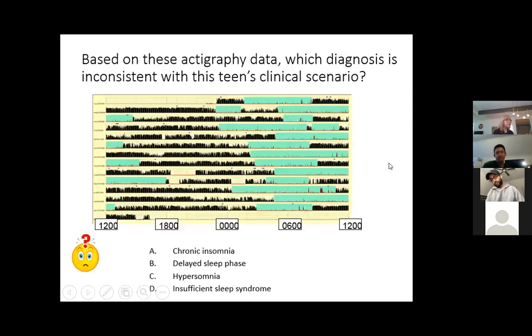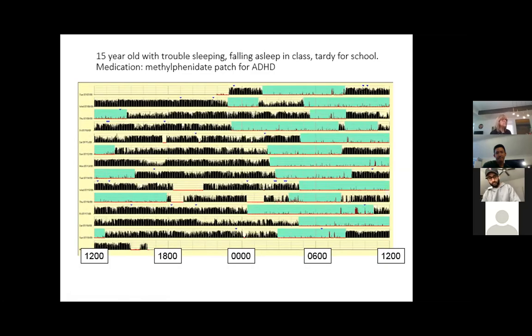And how do you distinguish between the time the device is off and sleep? I know that sometimes it can be confusing. You should have a little ditzels. Mm-hmm. You need a little noise. If it's zippo, it's probably off. Got it. Zippo and ditzels. That's very scientific. Sure is.